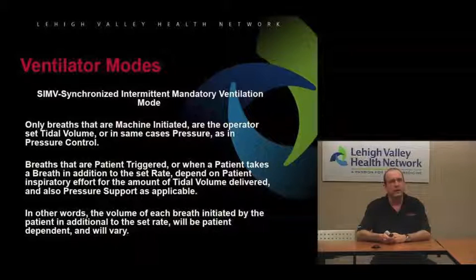Now, along with that, to help the patient from getting tired or to kind of assist them, for those patient trigger breaths in the SIMV mode, we usually turn on some pressure support. And this will help give them a little bit of a boost when they take in the breath on their own.